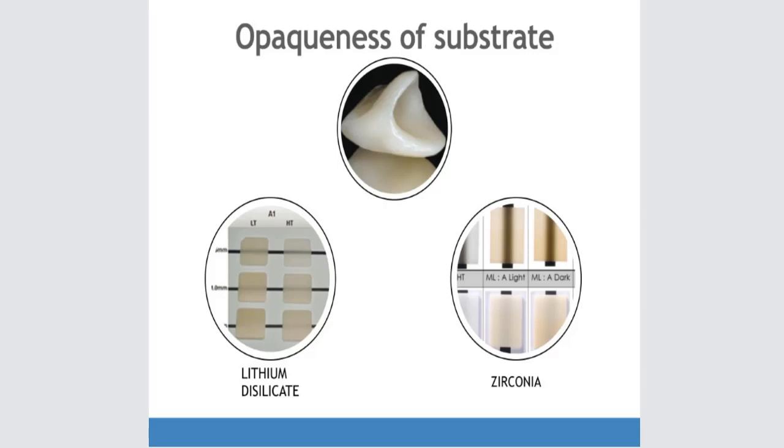So we want to think about this in our lights, definitely in terms of adhesives, also in terms of resin cements, but how about in terms of just our substrates, how we're using our lights to cure through these substrates for our resin cements, okay? We'll talk about this in a little bit, but I want you to appreciate that these substrates are very opaque.